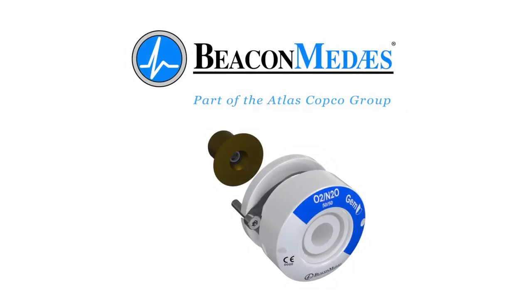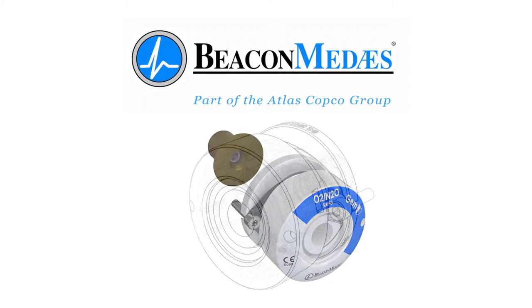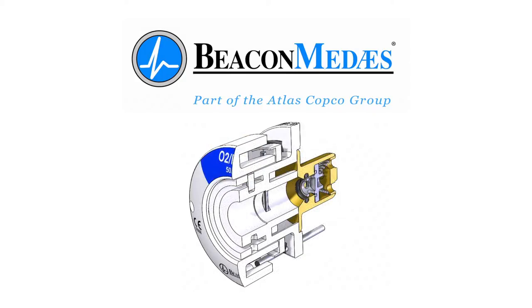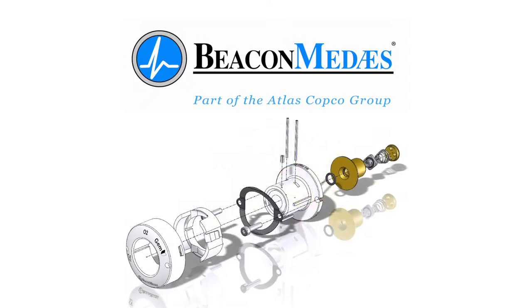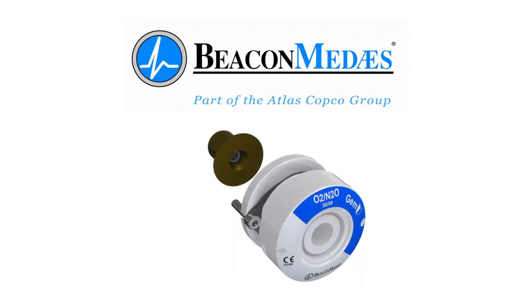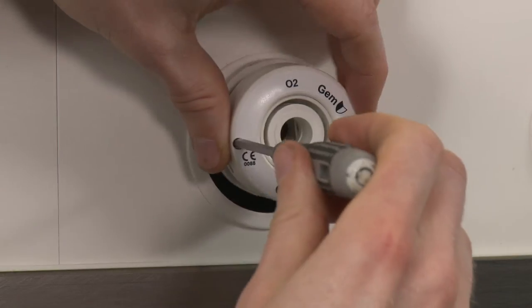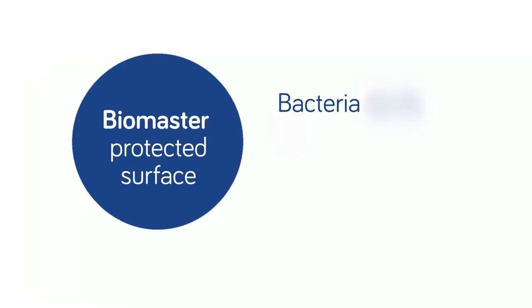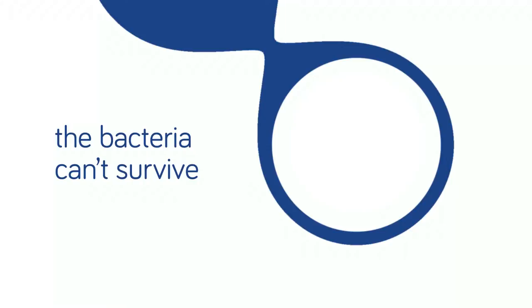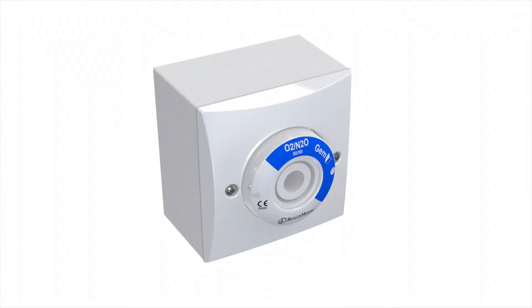Beacon Medeas are pleased to introduce the new GEM Shield British Standard Medical Gas Terminal Unit. The world's most trusted outlet just got better. The next generation of gas outlet, the GEM Shield, provides improved maintenance and installation, antimicrobial protection for patient safety, and a curved, more modern appearance.